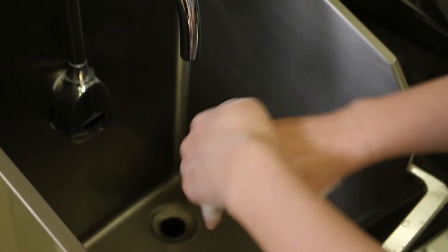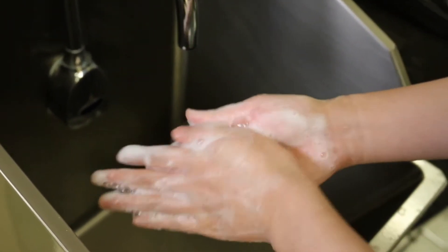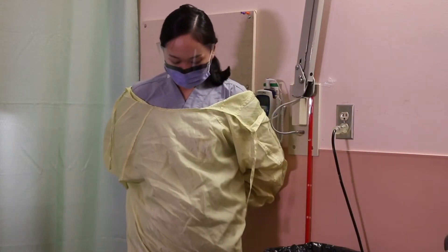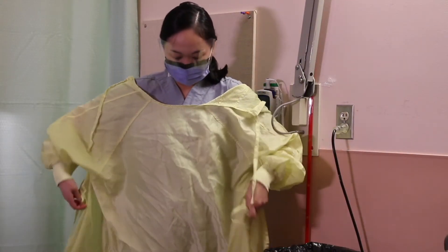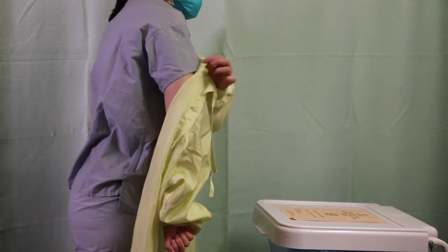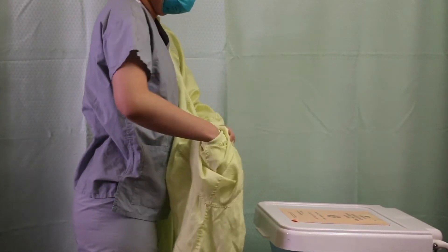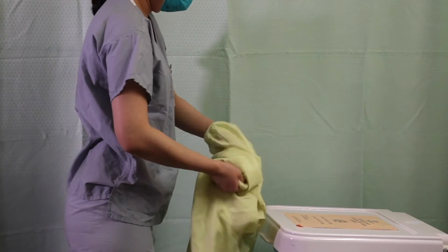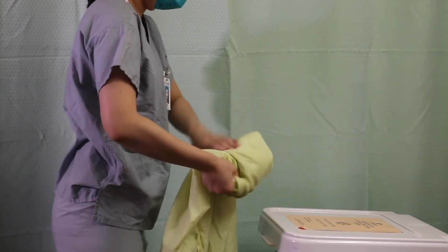Do hand hygiene to decrease the risk of self-contamination. Then remove the gown in a manner that prevents contamination of clothing or skin. Starting at the neckties, the outer contaminated side of the gown is pulled forward and turned inward, rolled off the arms into a bundle, then discarded immediately in a manner that minimizes air disturbance.